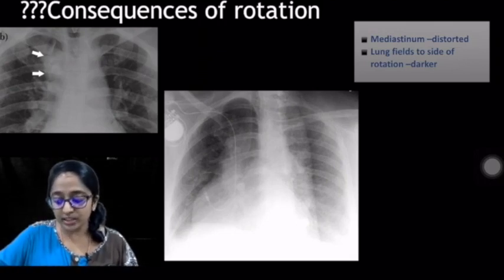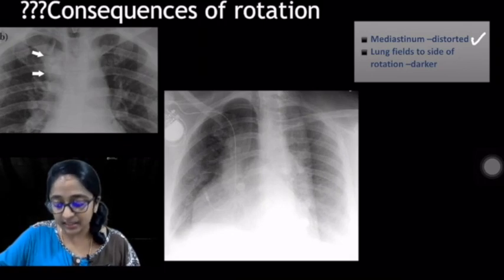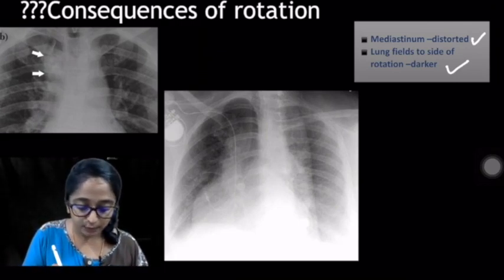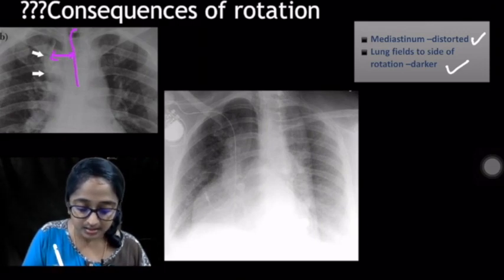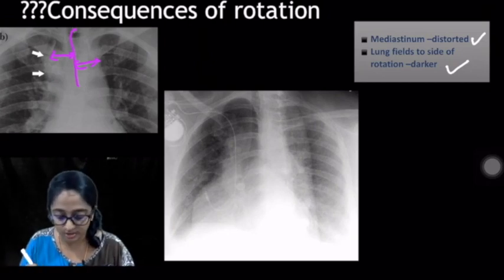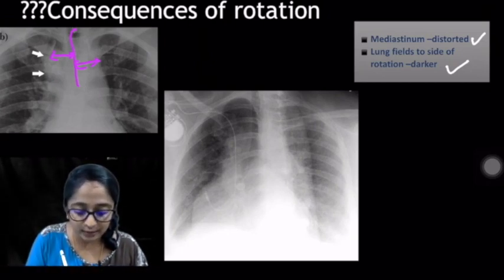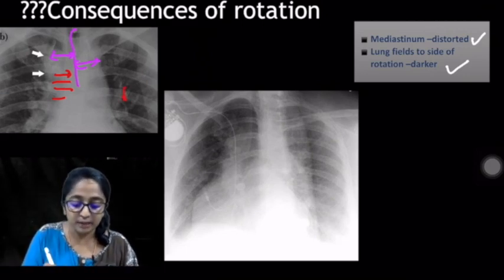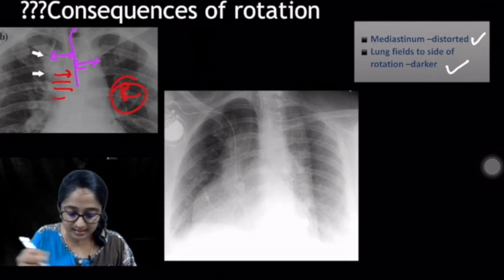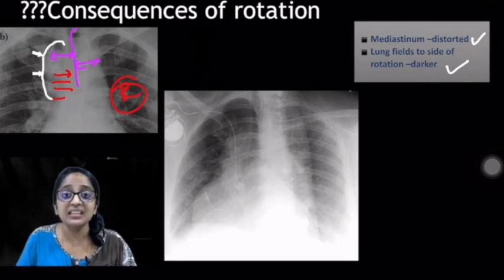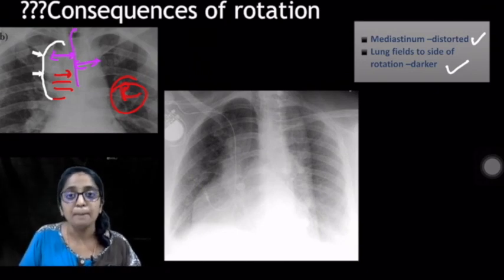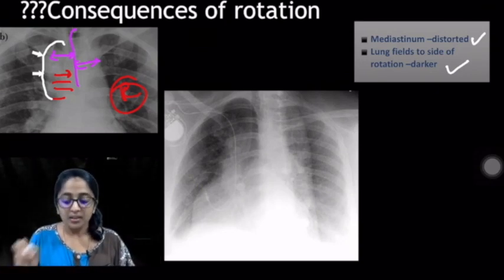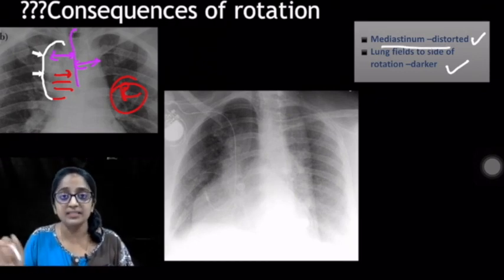What's the problem with rotation? Two things: the mediastinum will appear distorted, and the lung fields on the side of rotation will appear darker. In this example, the radiograph is rotated to the right, and you can see an added opacity in the right upper lung zone — these are distorted, magnified mediastinal vessels projecting into the lung fields and mimicking pathology. This is one of the drawbacks of a rotated film.